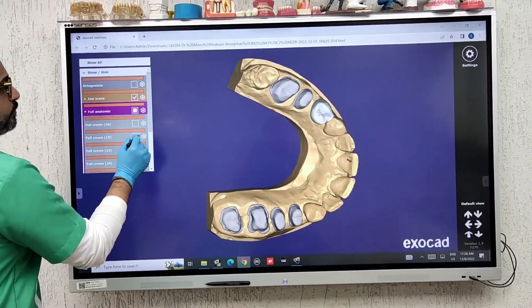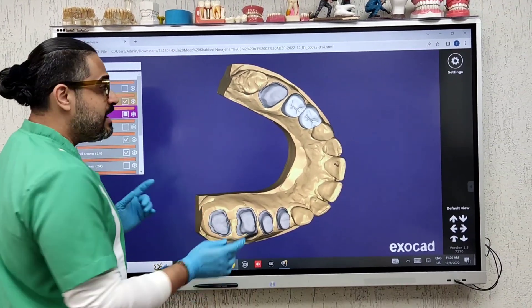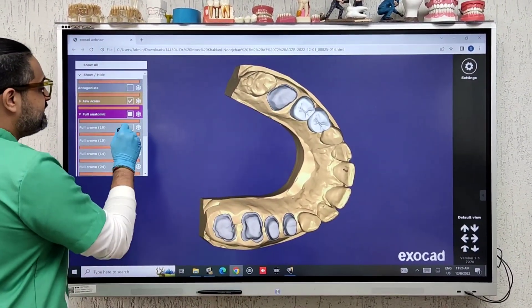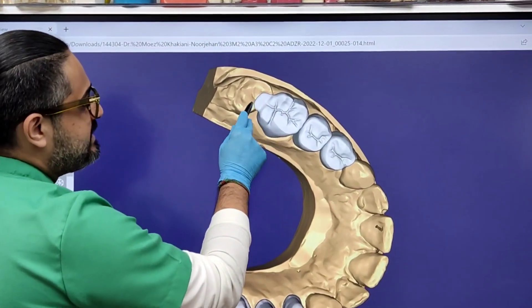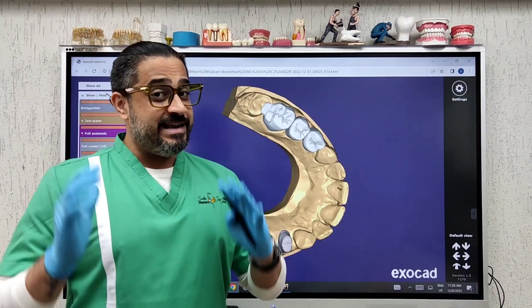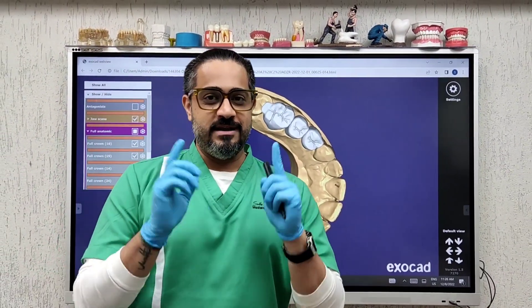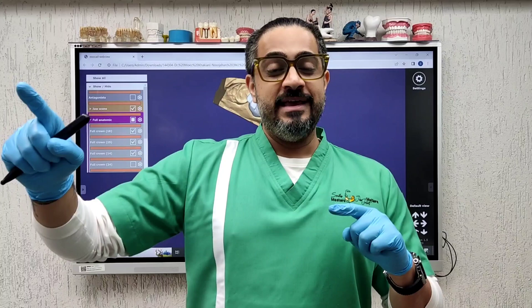The contours of the first and second premolar are kind of standard, but it's the first molar design which is critical. As you can see, the small extension over the seven is what is going to do the trick — it ensures that the upper seven does not supra-erupt. It's a small change in your design, but it can evade a major complication in the future.